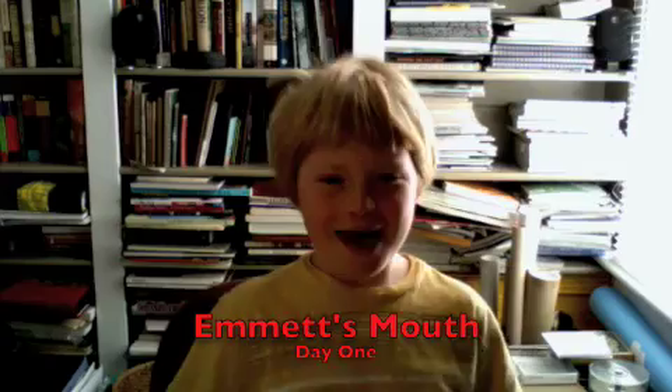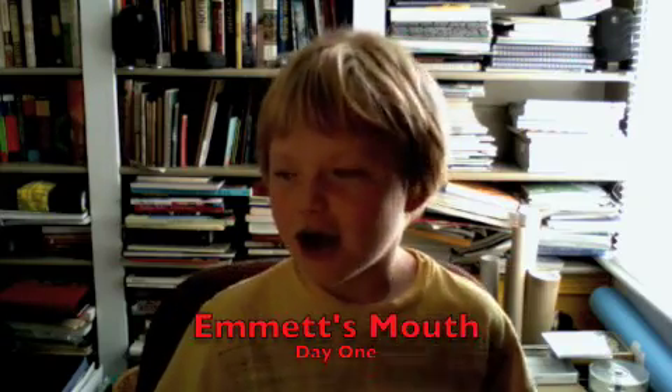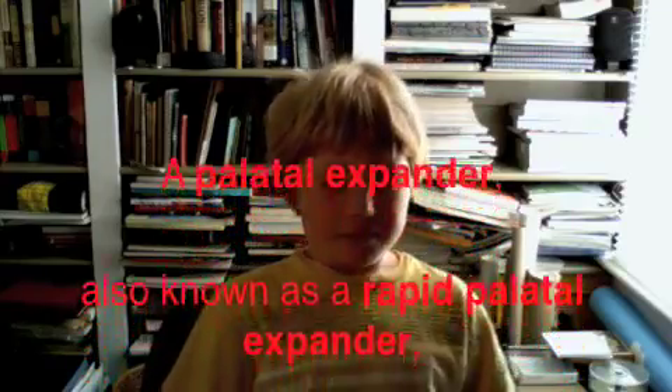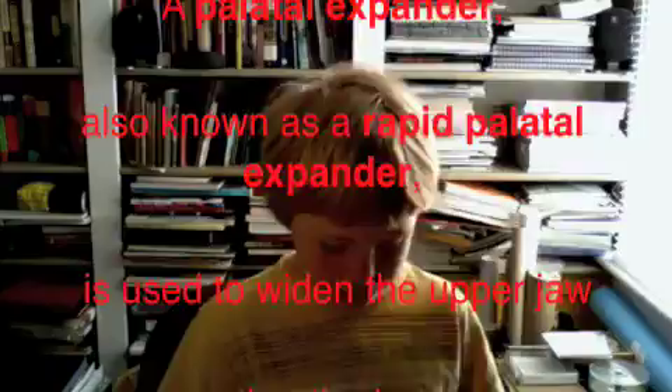Hi, this is Emmett and I got this spreader put in my mouth yesterday. I wanted to tell you, in case you're getting it, what it's going to feel like.